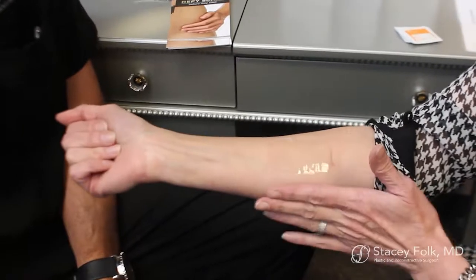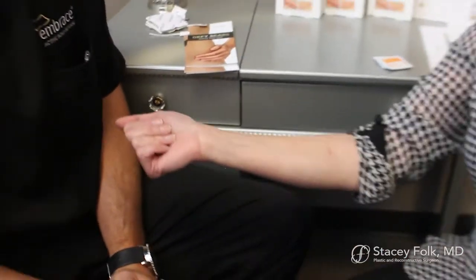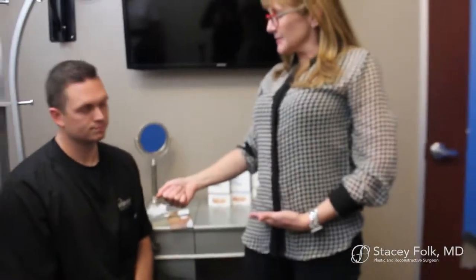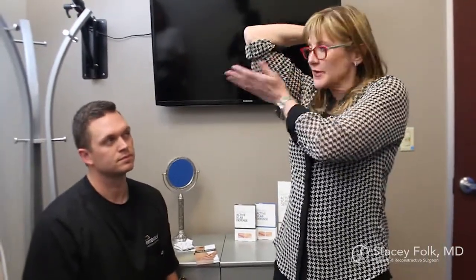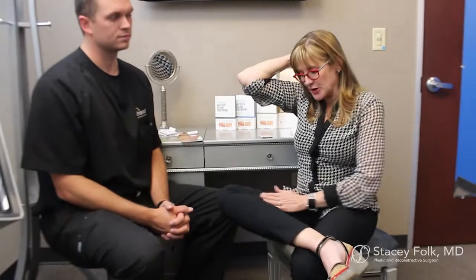There are some hints about putting this on. So if you're going to do your abdominoplasty incision, it's best to do it standing and apply it in a mirror or laying down flat. So you don't want to be hunched over when you put that on. If you're doing a brachioplasty incision here, think about putting your hand right behind your head and applying it like this. If it's an inner thigh lift where the seam of your pants is here, you may just want to cross your leg and apply it just like this.